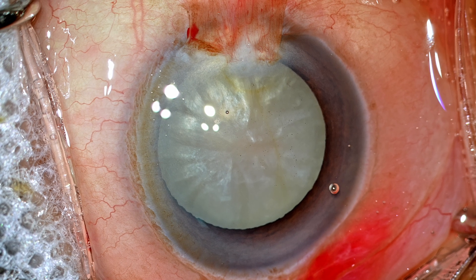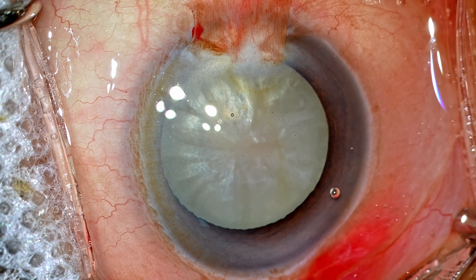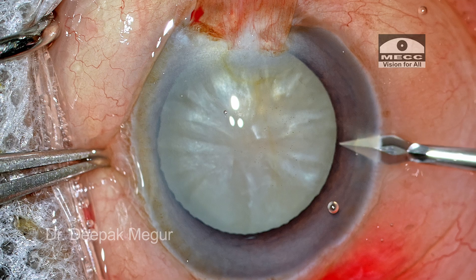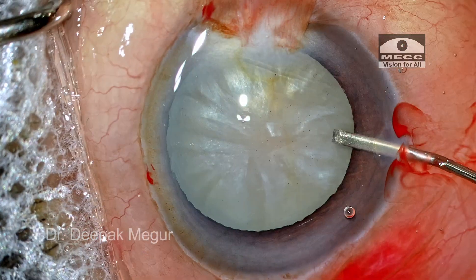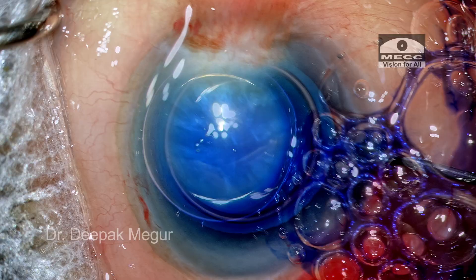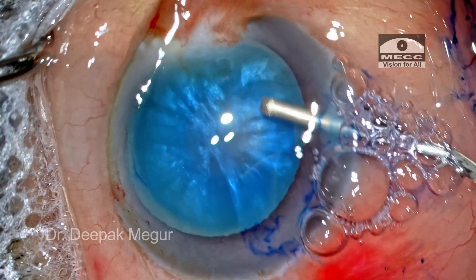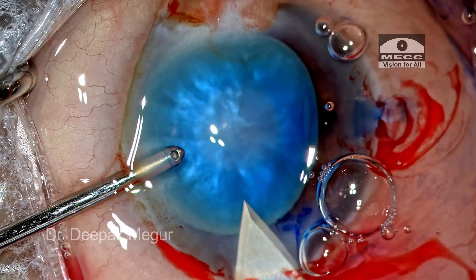This is what we did, and the patient's IOP was normal as the patient is being draped. The surgery is being done under peribulbar anesthesia with a massage — the eye is soft. Side port incisions are made. The capsule is stained under an air bubble with trypan blue and then the dye is washed off. Dispersive OVD is placed inside the anterior chamber, and a 2.8 millimeter posterior limbal-based incision is created.